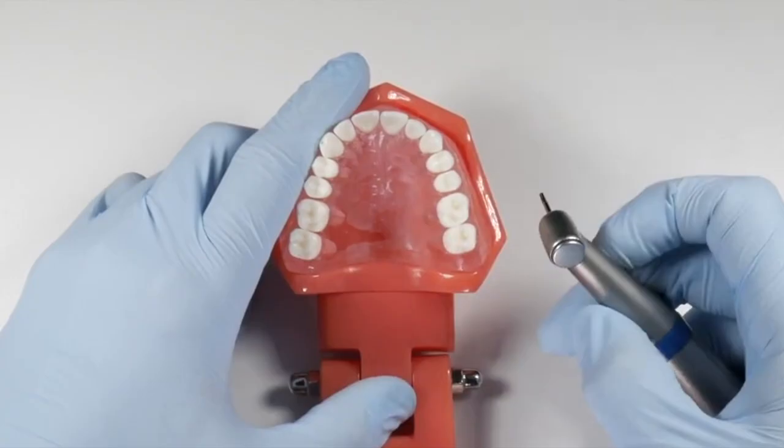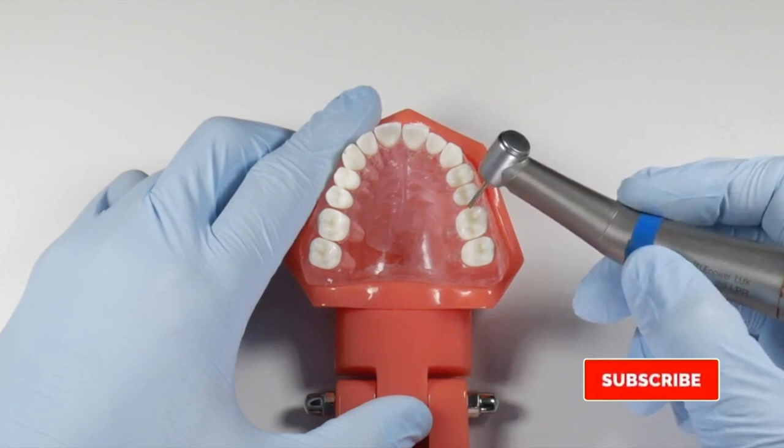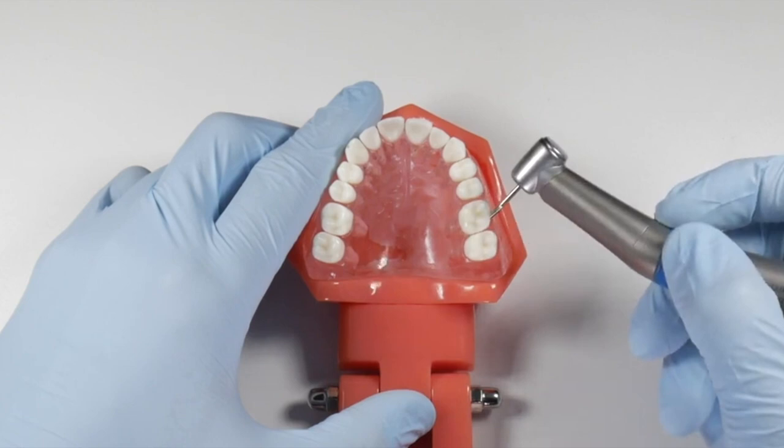That's going to save you because you can now section that tooth a little differently than you had planned. Say the distal and palatal root is fused — you may just section down around the mesial root to get that one disconnected and out of the way. If you wouldn't look at that initially, you'd cut through here, section down partway through that distal and palatal root, and cut deeper thinking you're trying to get through the furcation — really just obliterating that root and weakening it to make your job more difficult.